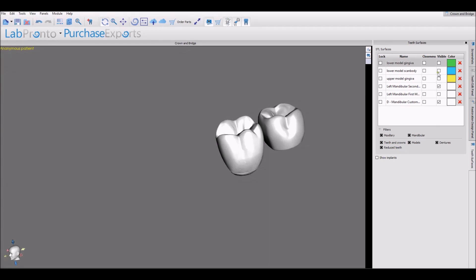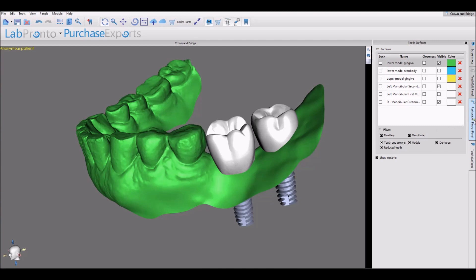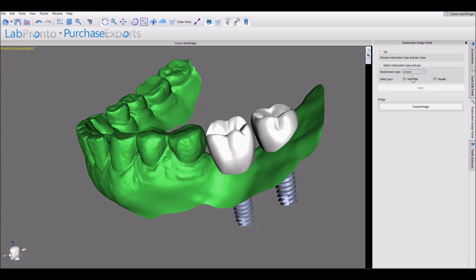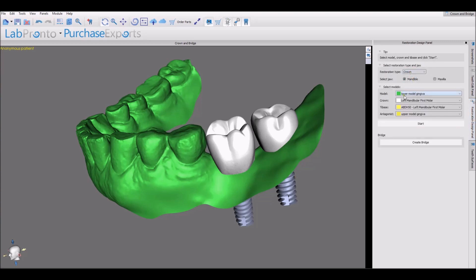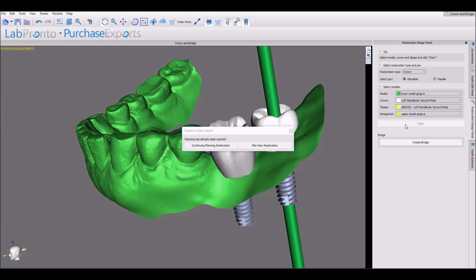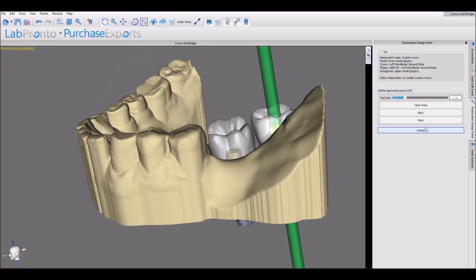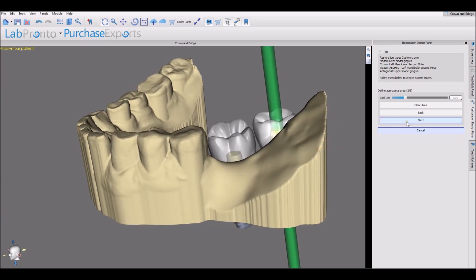Creating the second crown is a very similar process. Go back to the Restoration Design panel, select Mandible, and make sure the settings are correct. Change it to the second molar, tie base for the second molar, and press Start. We're planning a new restoration — not continuing to plan the previous restoration. Set the insertion direction, then define the proximal areas, which is not relevant for this tooth.